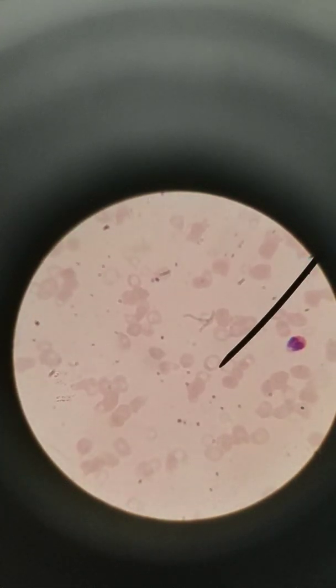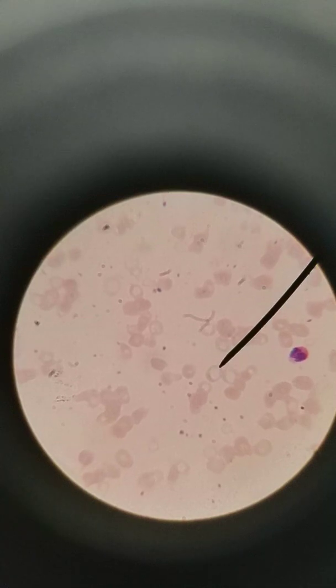The opposite of microcytic is macrocytic. So these are macrocytic and still hypochromic because it's very light in the middle. Macrocytic hypochromic anemia. This is caused by a vitamin B12 deficiency. How can that happen?